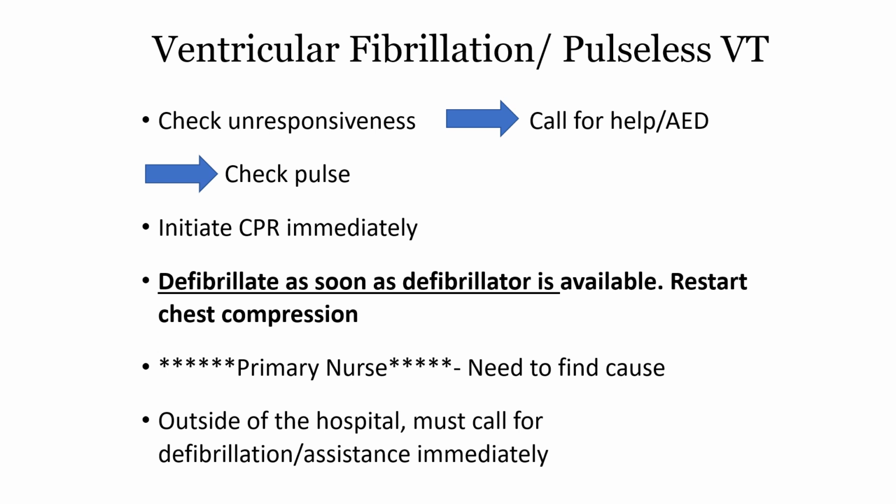We're going to initiate CPR. When the defibrillator or the AED gets back, we are going to hook it up to them and we are going to continue compressions. When the monitor is assessing their heart rhythm, it will say stop compressions, assessing with the AED, and it will tell us if it's a shockable rhythm.